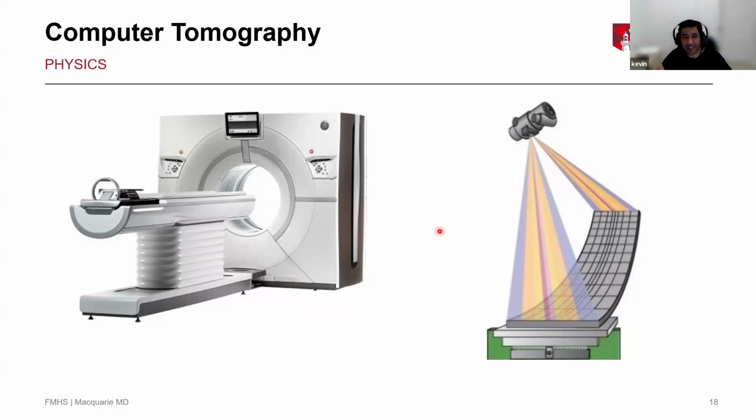Okay, the answer is, in terms of the technology, the scanners, about 20 years ago, the 3 main vendors went down different paths. So the Siemens scanner said speed is all that is more important. To give you an idea of how fast this whole contraption is spinning around, it's something like 3 times a second.